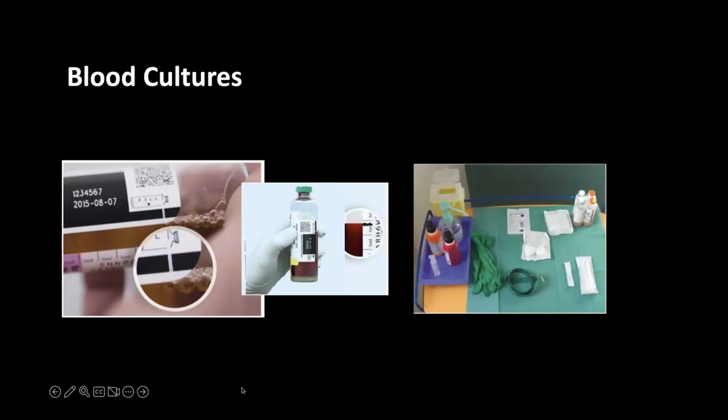So with blood cultures, the main issues are low volume and contamination. Collecting less than 10 milliliters significantly reduces the yield, and using only one set risks contamination sometimes, so proper labeling and technique is necessary.